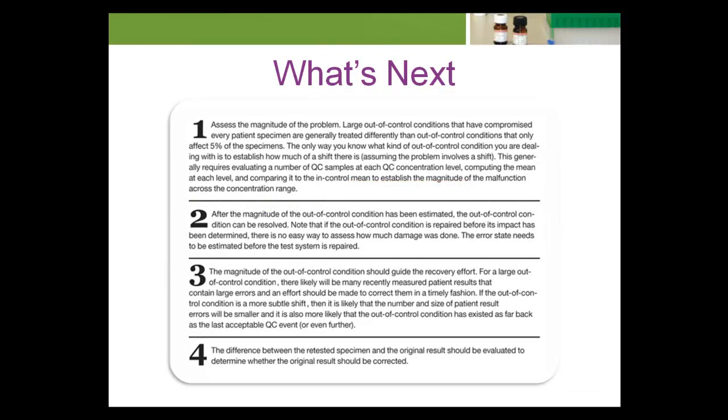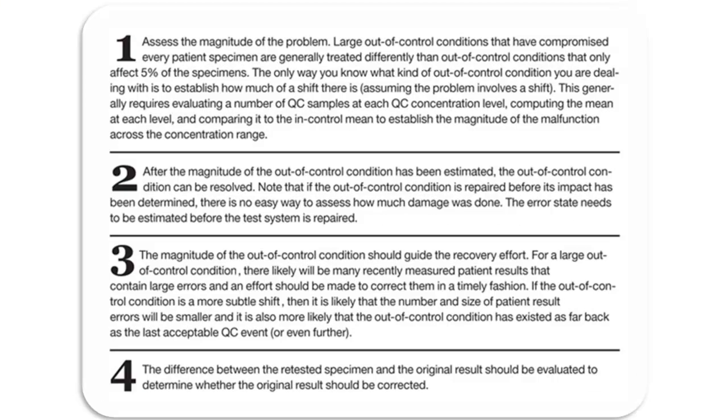In summation, after an out-of-control condition has been detected, there are several things that should be done. We suggest that you pause the video. This will allow you to review the following recommendations.